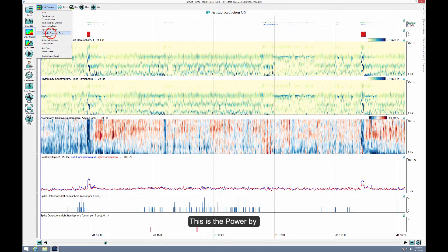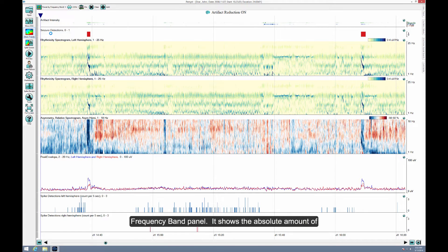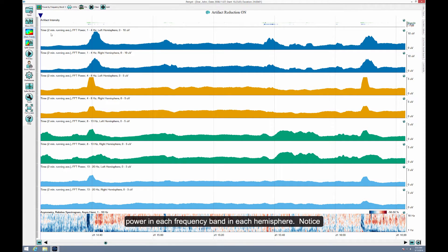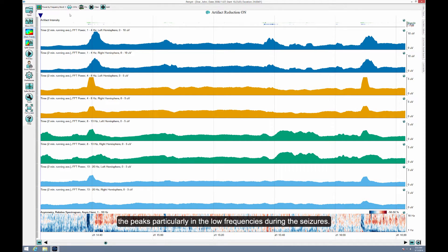This is the Power by Frequency Band panel. It shows the absolute amount of power in each frequency band in each hemisphere. Notice the peaks, particularly in the low frequencies during the seizures.